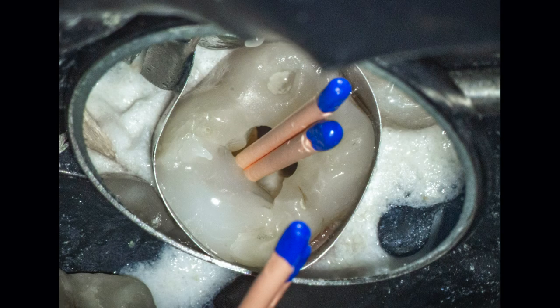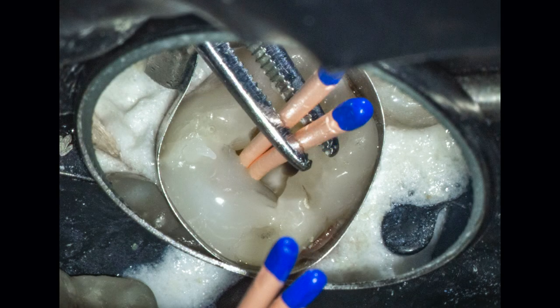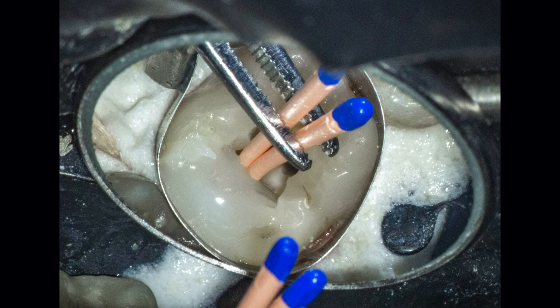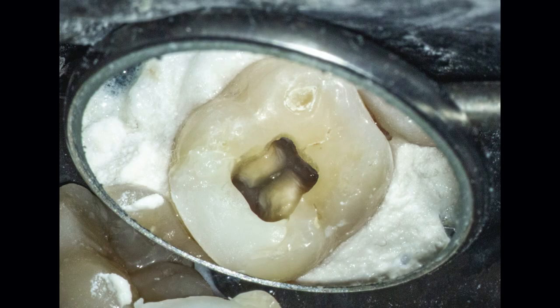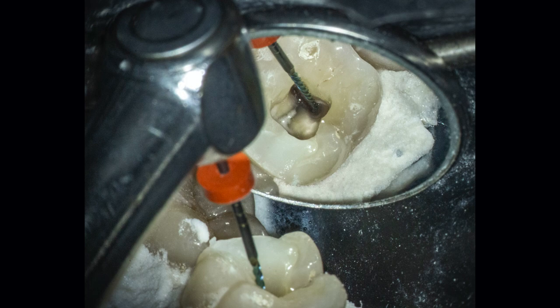I'll apply some bonding and flow a dual cure bonded resin material freely in that distal box. Once cured, I can grab those gutta percha cones and if I've got straight line access, they'll come right out. And if they don't, that's okay too — you can use those as a pilot to re-access that canal if needed. I then go through my normal instrumentation and irrigation protocol without concern of that area towards the distal.